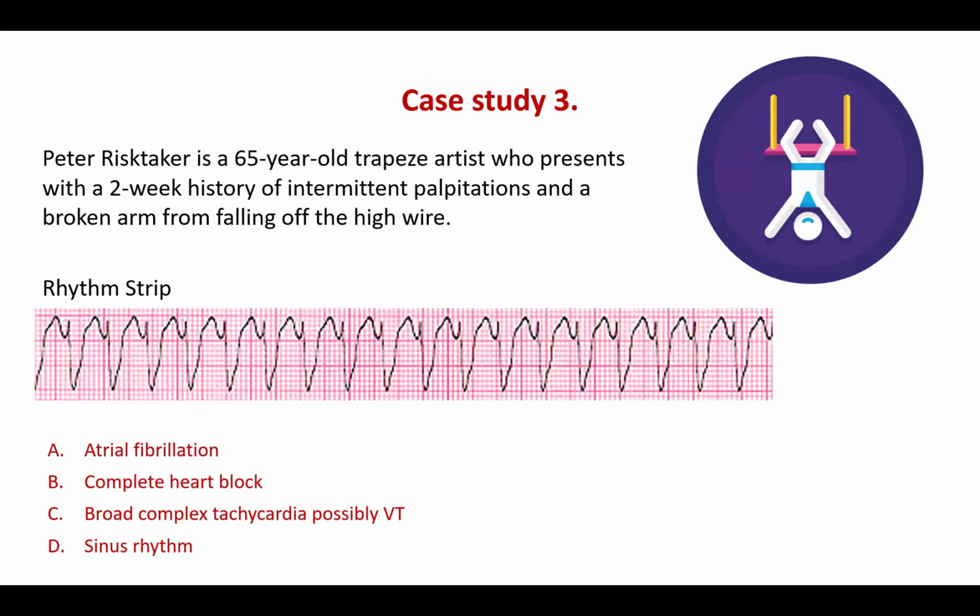Great, thank you. And if we're doing an ECG on a child, do we do it the same way as we do an adult, say if we have a 5 to 12-year-old? Yeah. So you would still do the same anatomical markers. Yes, you'd still do the same ECG. Of course, they're going to have different heart rates and things.